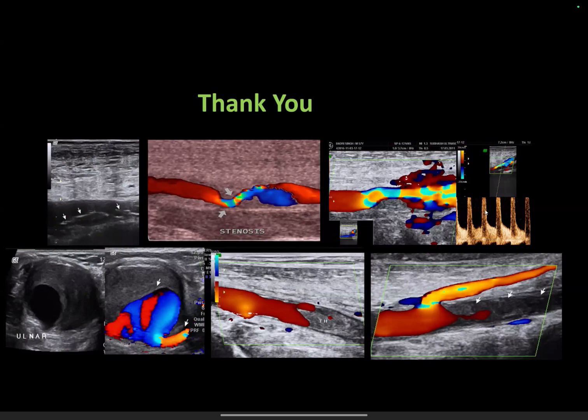As far as the spectrum is concerned, when the PRF is low at the time of insonation of any vessel and the velocities are high, then again we see aliasing, in which the higher velocities will be wrapped below the baseline and you will not achieve a good spectrum to interpret. There are two ways for it. Either we lower the baseline, or we increase the PRF so that the majority of the blood flow velocity is captured by the PRF. PRF will be doubled, so it will pick the flow signals of that particular sampling area. So there are two methods, and another important one is spectral gain.